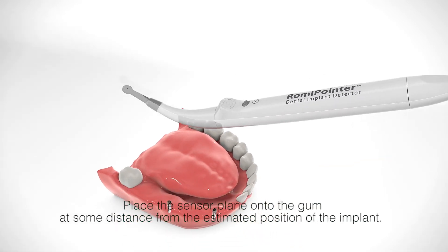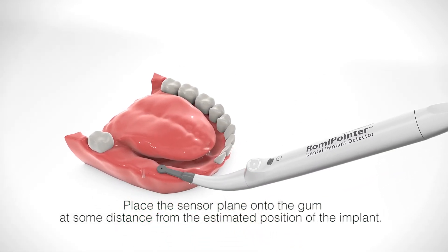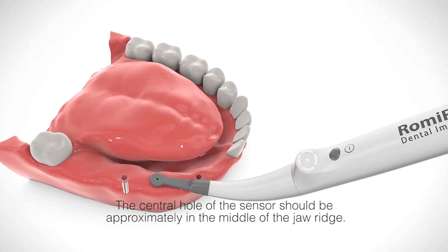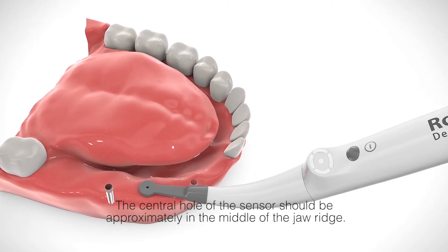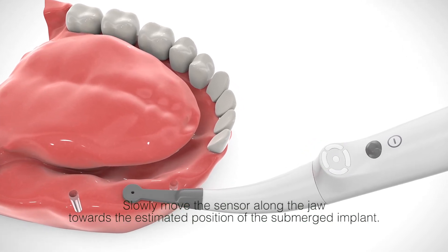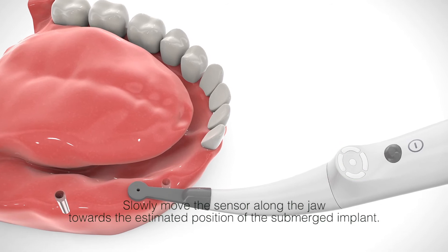Place the sensor plane onto the gum at some distance from the estimated position of the implant. The central hole of the sensor should be approximately in the middle of the jaw ridge. Slowly move the sensor along the jaw towards the estimated position of the submerged implant.